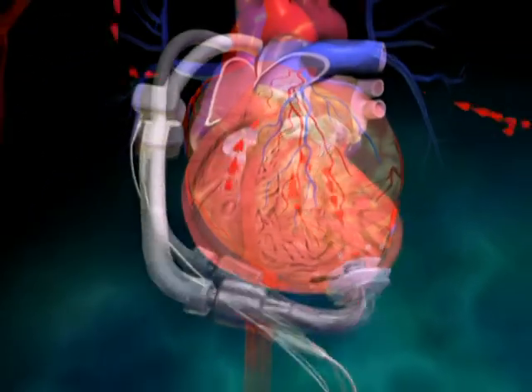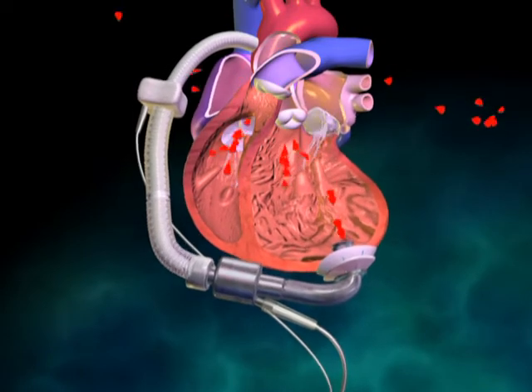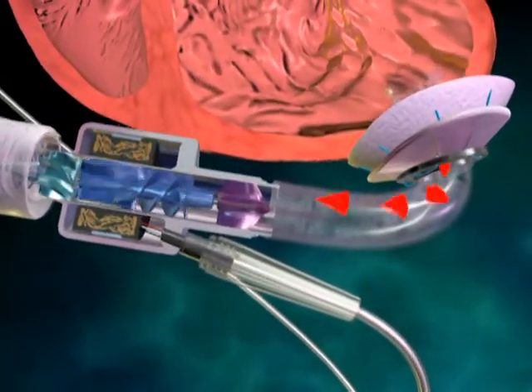All clamps are removed, and pumping is initiated at a speed of 7500 RPM, which should provide a flow of approximately 2.0 liters per minute, which then increases as the patient is weaned from bypass.